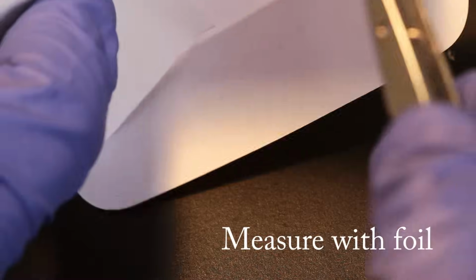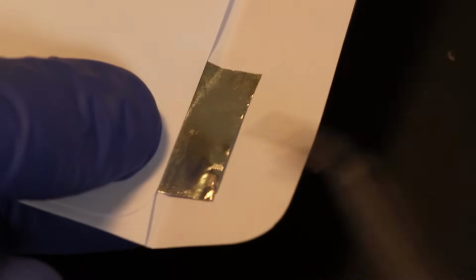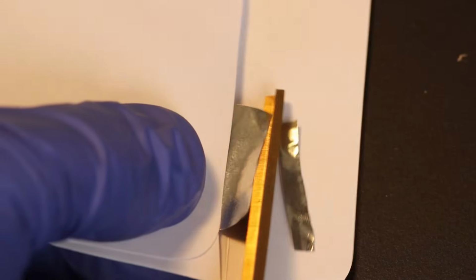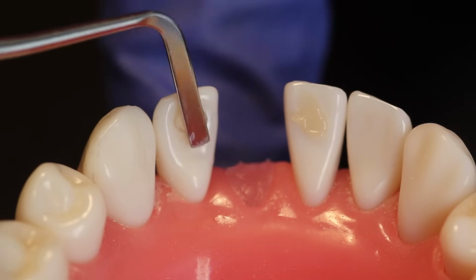Measure the area where the ribbon will be placed using the dead soft tinfoil provided in the ribbon kit. Waxed dental floss can also be used as well. Then cut the ribbon to the corresponding length. A small amount of tacky composite can be used to help hold the template in position.